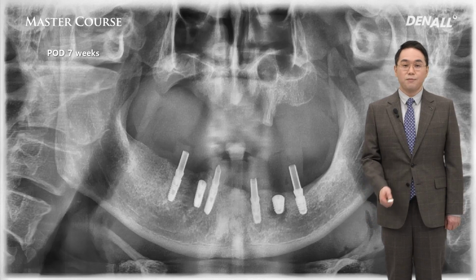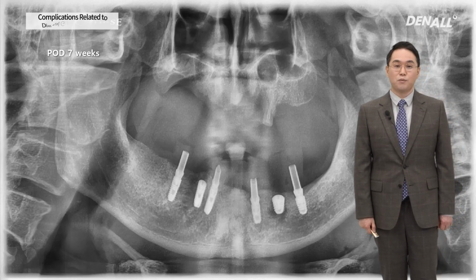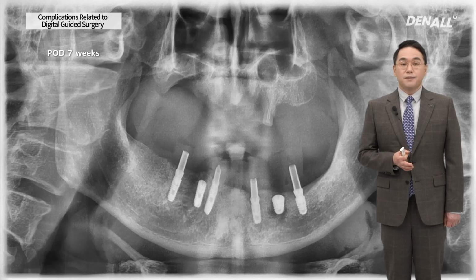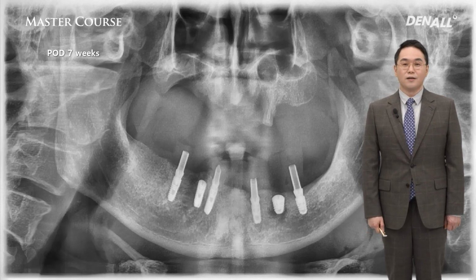Although the 7.0 implant was placed on the apical area, you can see an extensive bone defect. I believe that is heating necrosis. Number 34, that was the problem. Number 36 was okay, but why just number 34?